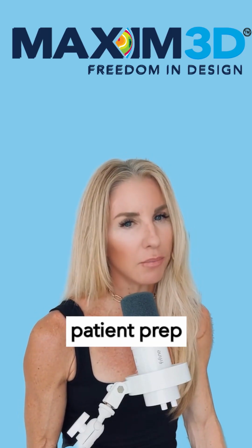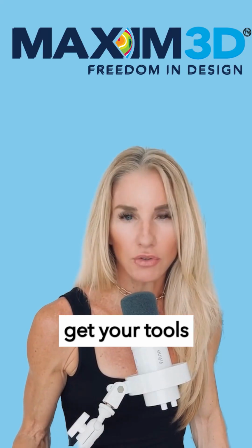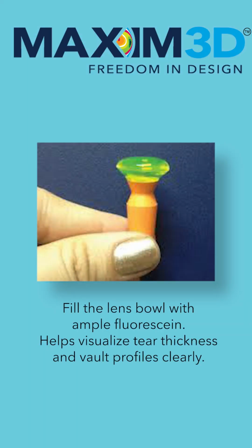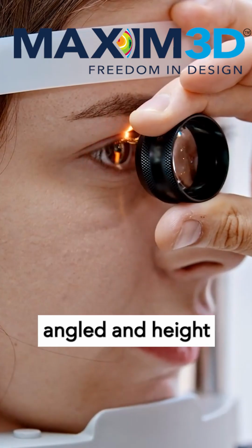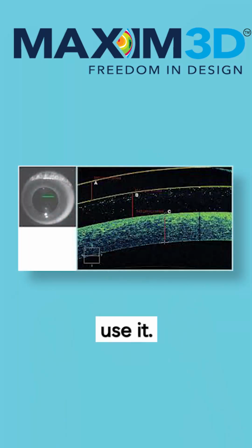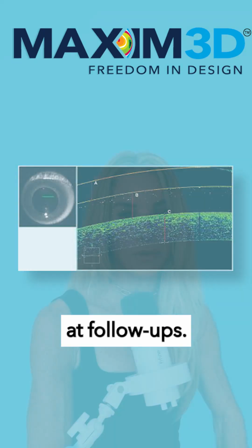Here are some patient prep and imaging tips. Before you start assessing the lens, get your tools and view optimized. Filling the lens bowl with ample fluorescein helps visualize tear thickness and vault profiles clearly. Use a bright white optic section on the slit lamp with the beam angled and height adjusted for a crisp sagittal view. If you have access to an OCT, use it. It provides highly accurate measurements and is particularly valuable at follow-ups.